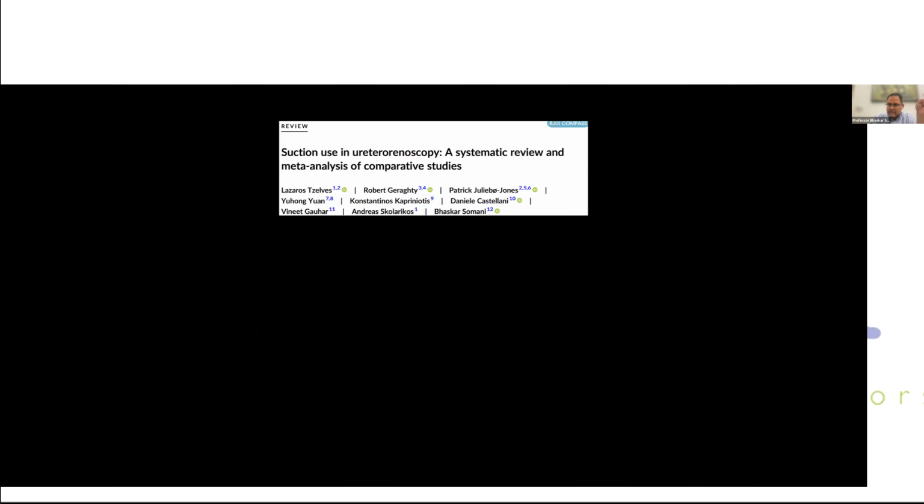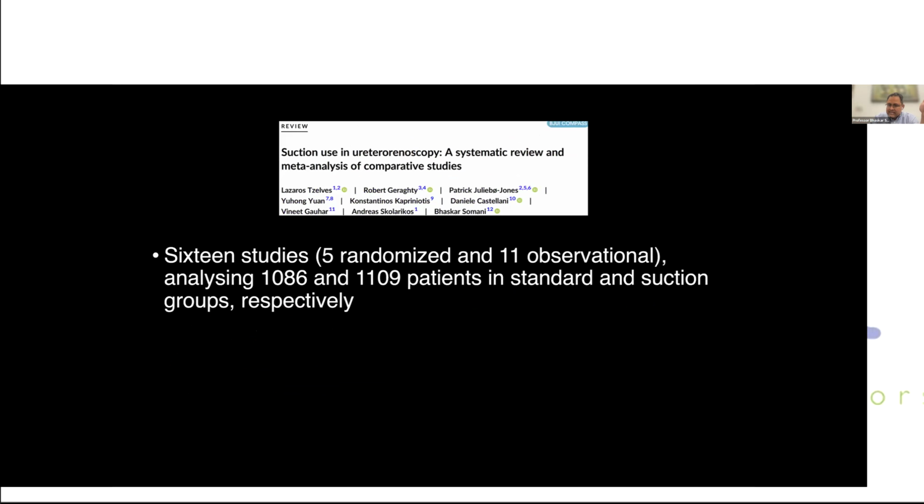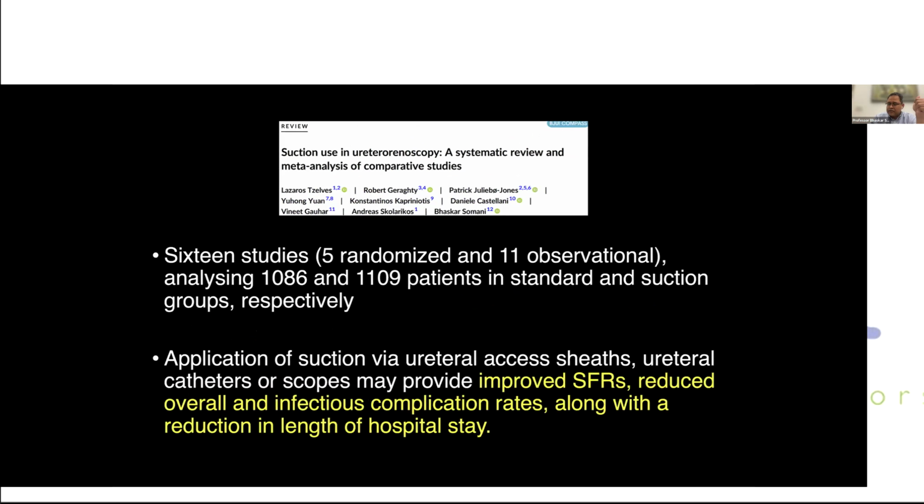So this is the most recent evidence of suction in ureteroscopy. This is a systematic review and meta-analysis published just last week. 16 studies were included, analyzing over 1,000 patients in each of the suction and standard groups. The application of suction improves stone-free rate, reduces infectious complications, and length of stay. So now you've got the evidence to show that suction improves stone-free rate, improves the overall and infectious complication rates, and reduces hospital stay. Given that there are different ways of applying suction, with the suction scope and suction sheath, there is a definite improvement in parameters and it is definitely here to stay.